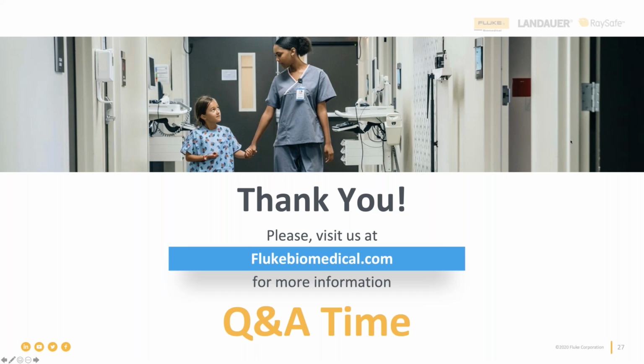All right, so the next question is also related to SpO2 somewhat. It's the oxygen type question, which is EtCO2 and capnography, are those the same machines? Yeah, so EtCO2 is what you measure with a capnometer or a capnograph. So what you're measuring there is the end tidal CO2, meaning the CO2 that's exhaled. So they're similar but not the same.